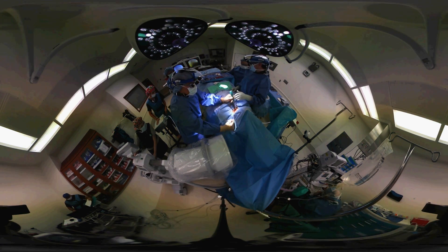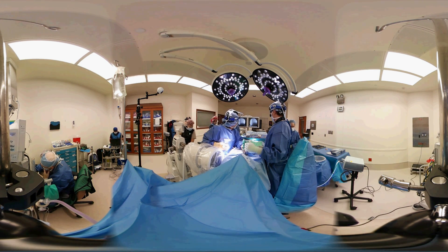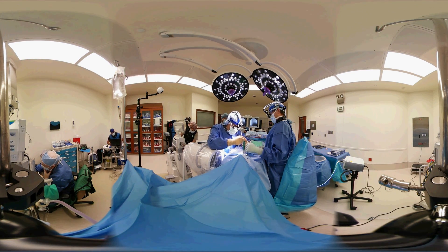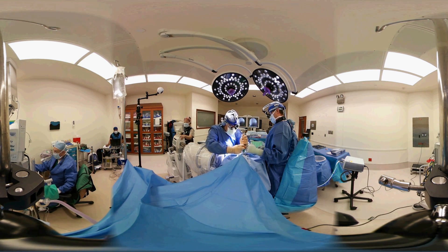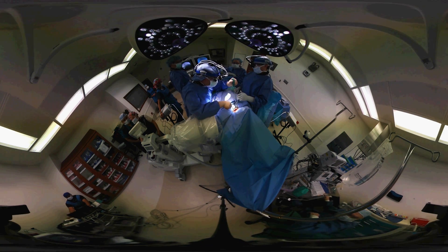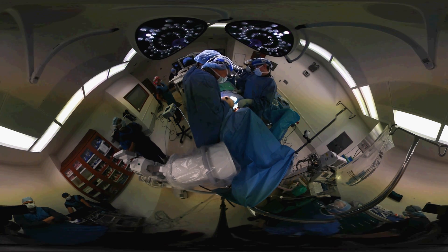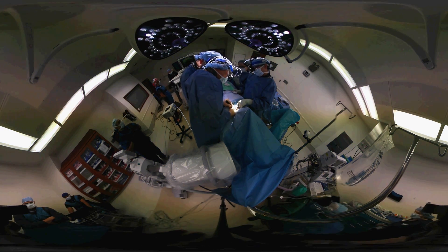The first part of the clean-out is to remove all the degenerative disc. The next part is to complete the clean-out so that we can clearly see from side to side, and then the last part is to insert the pins so that we can allow distraction and clearly visualize the spinal canal. It is this part of the procedure in which we balance the motion segment by removing the ligaments and, most importantly, removing the offending disc or spur that's pinching the patient's nerve.